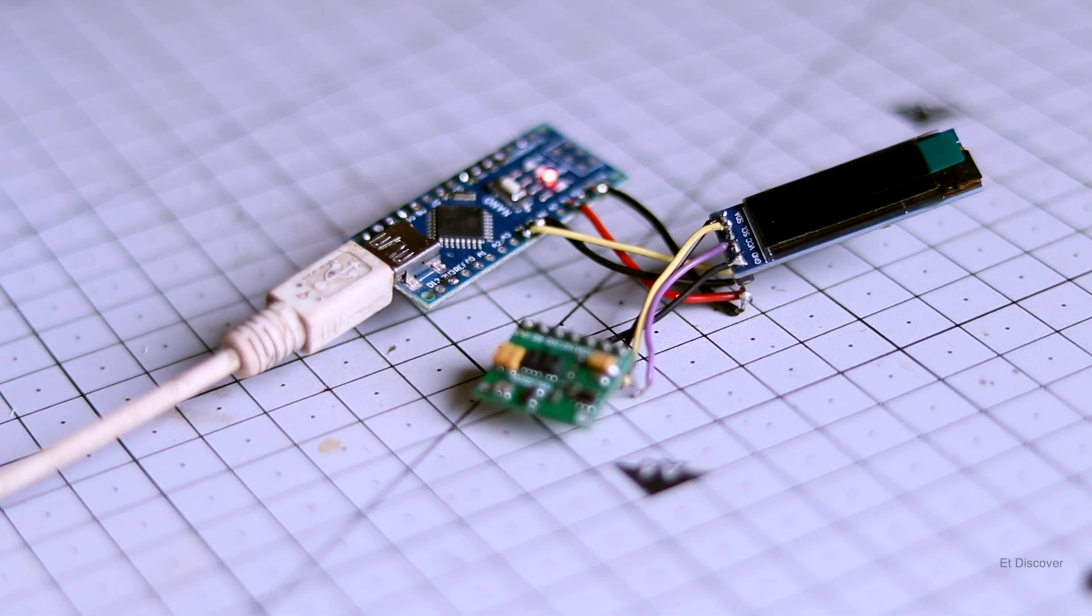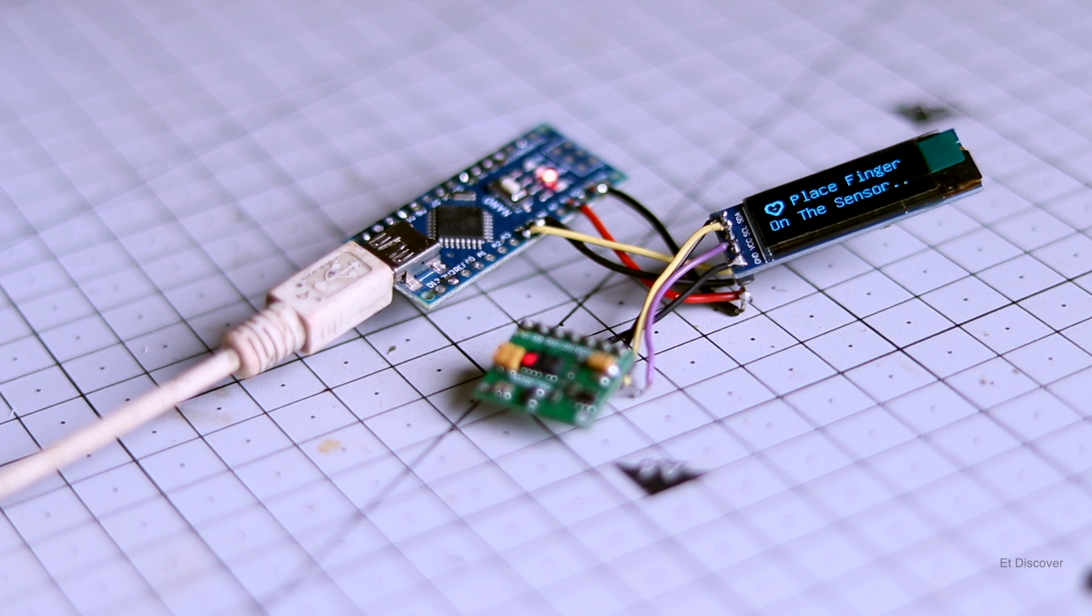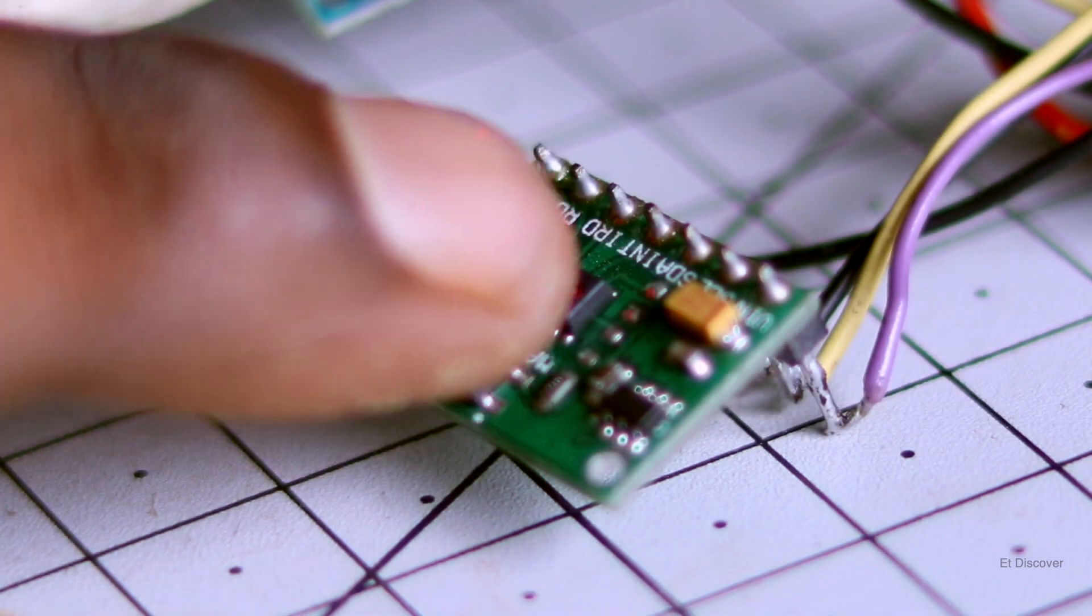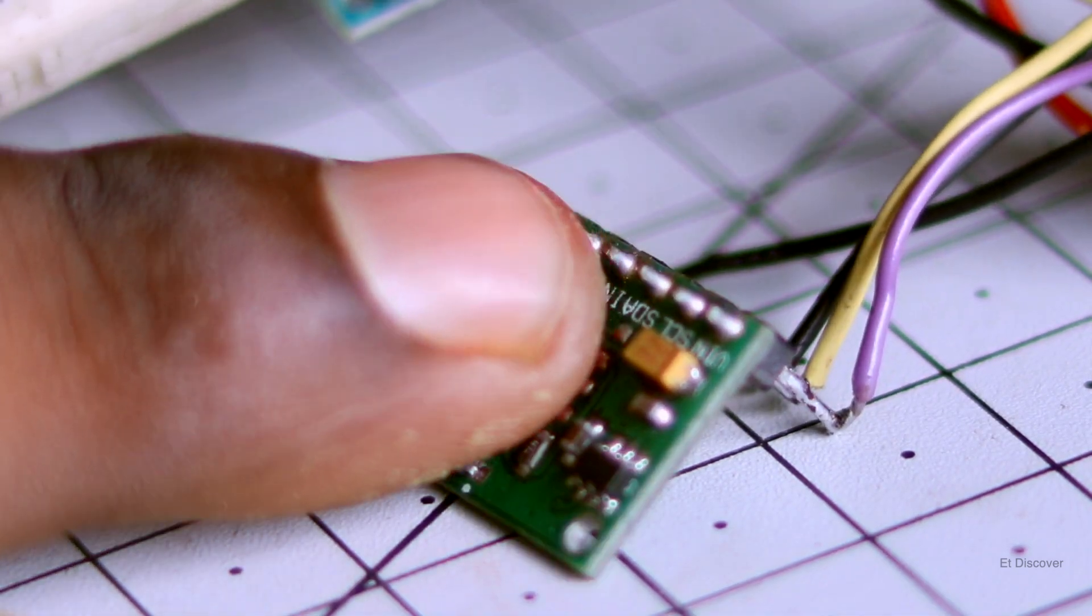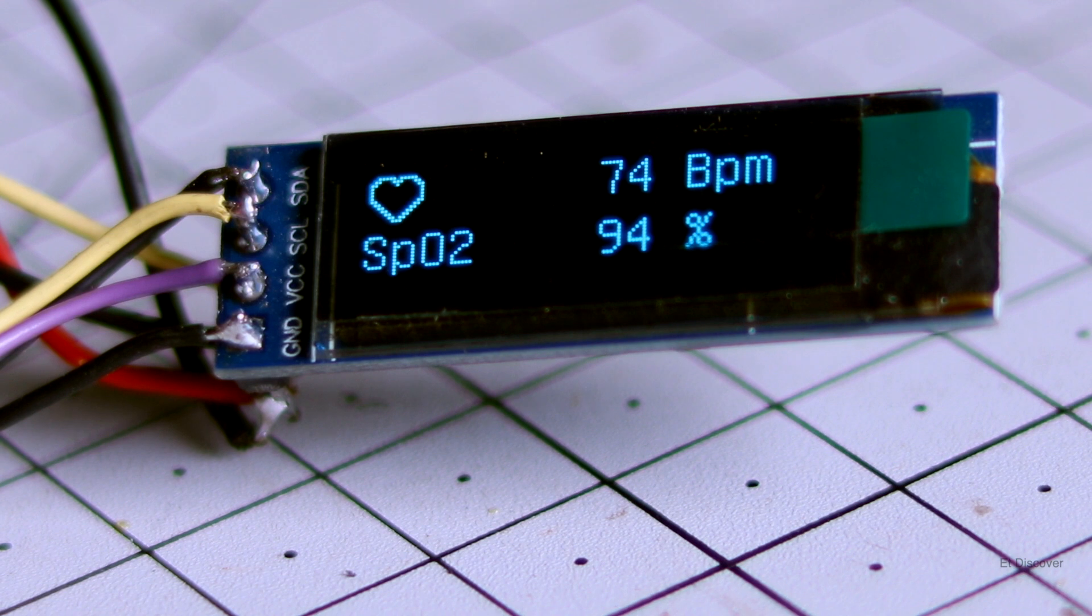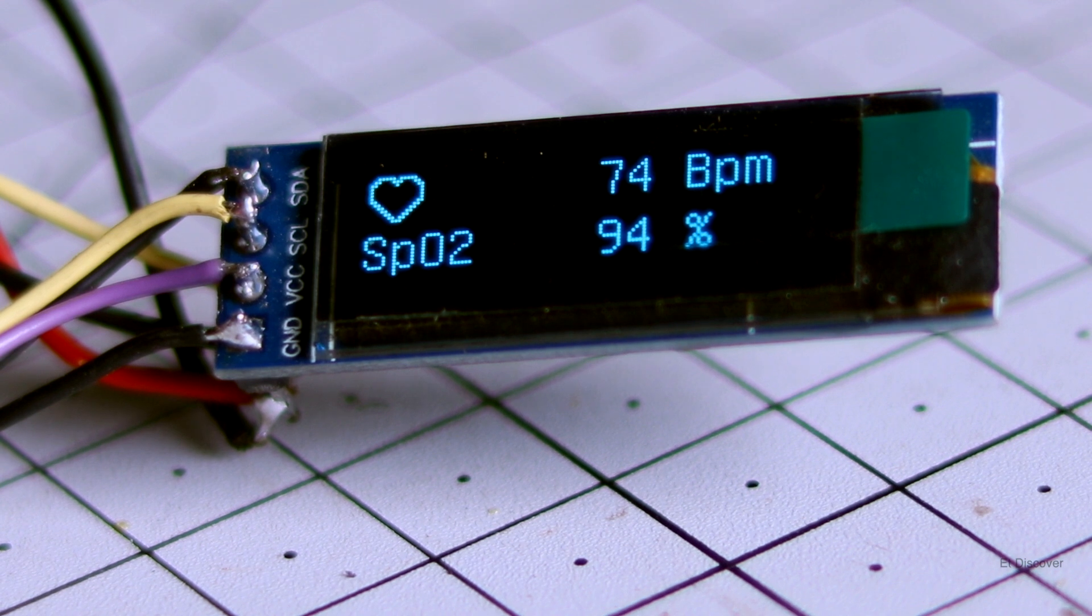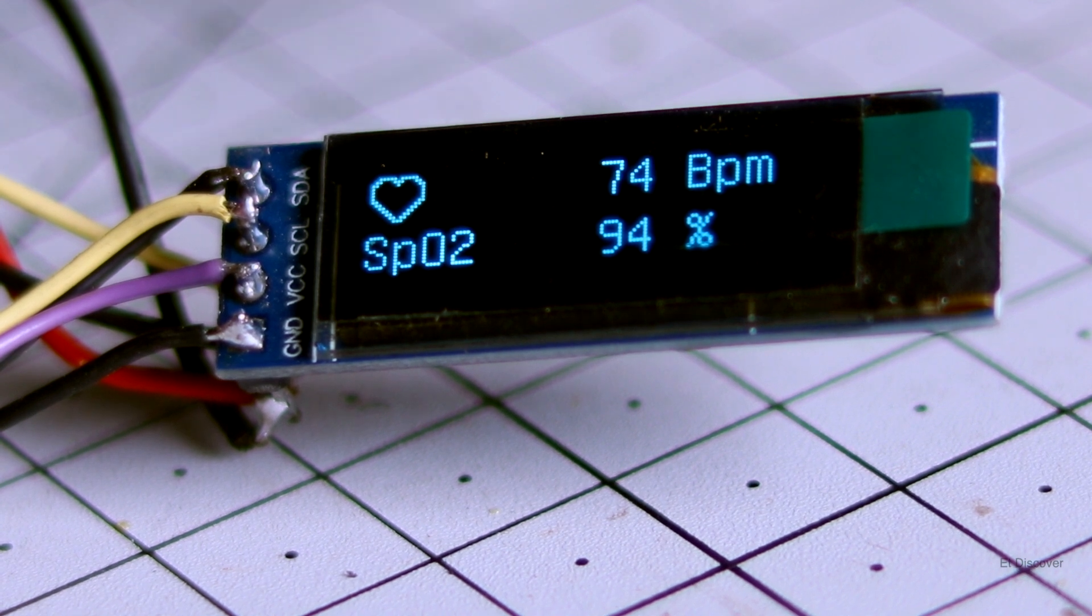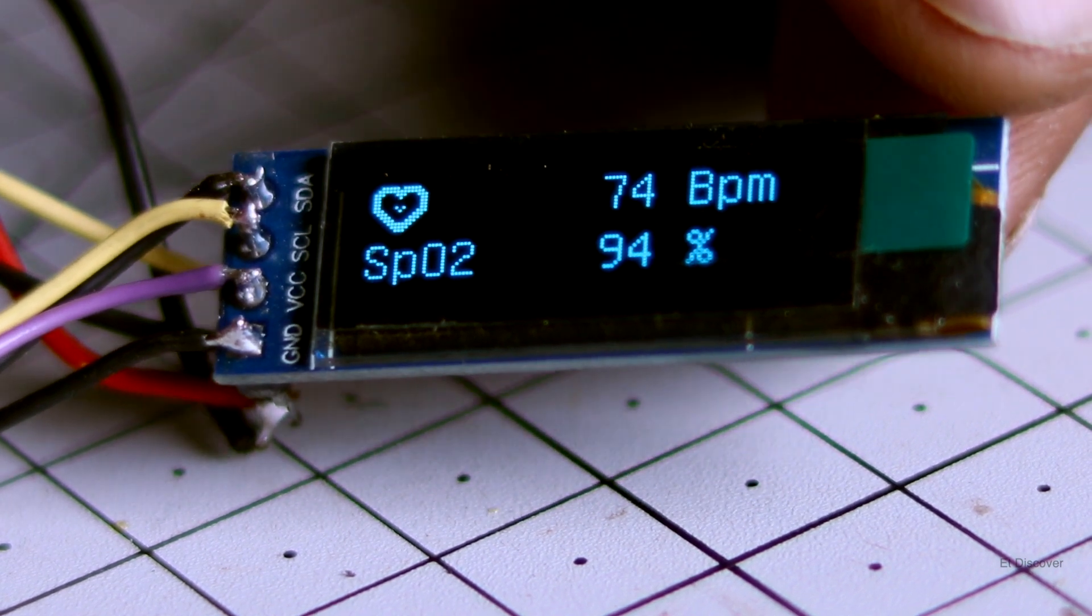And here you can see my OLED display is showing me some interface. And here is written put your hand. So that is why I keep my hand on this sensor. And after 5 seconds later, you can see my heartbeat is showing here even my body's oxygen level. So this is really awesome.